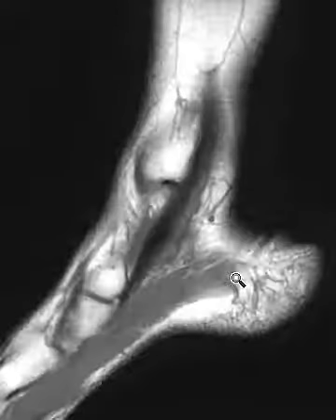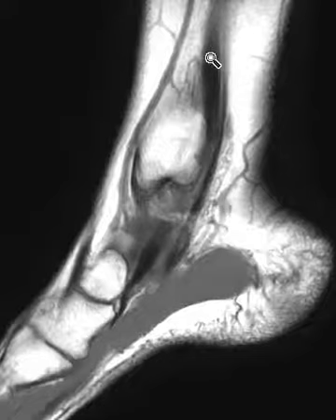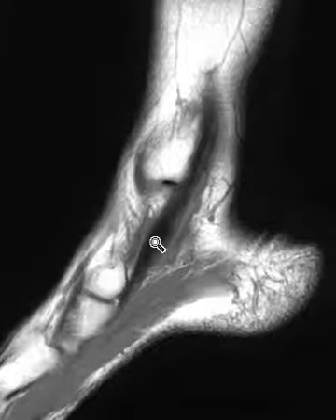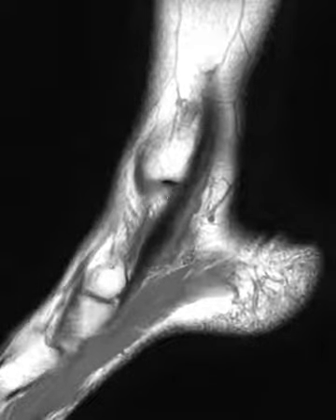So on the posterior tibial tendon, this is the medial side now, we do see this foggy posterior tibial tendon that starts up here, and it's just a little bit too plump. And right in here, it's not even very well defined, all the way down to near the attachment. So the whole posterior tibial tendon here is abnormal.